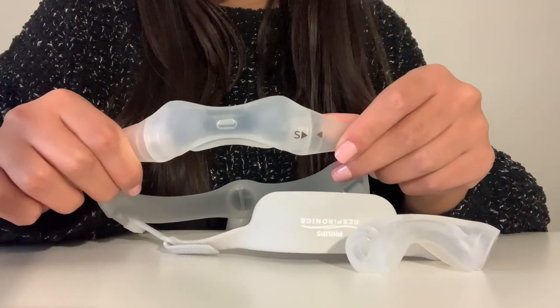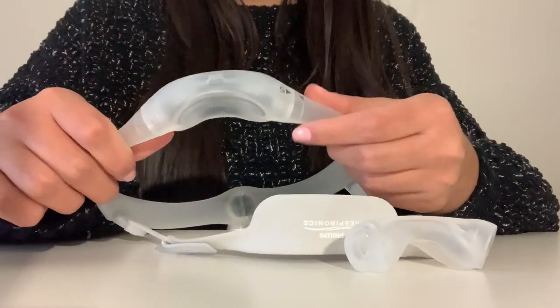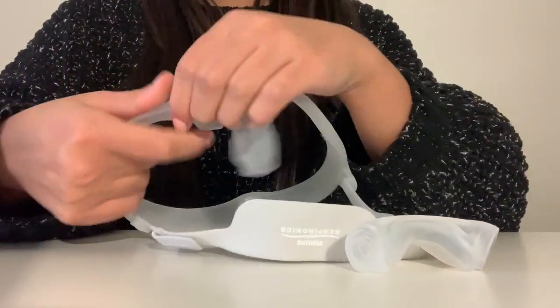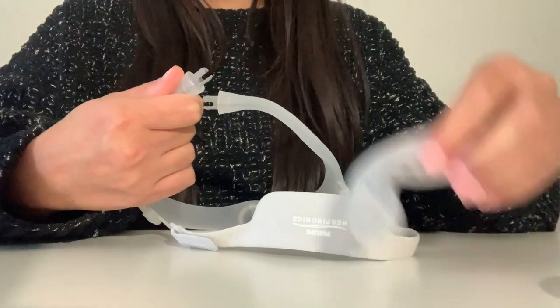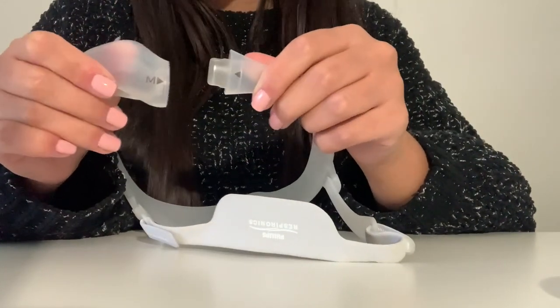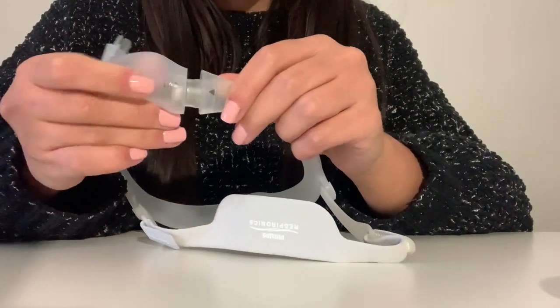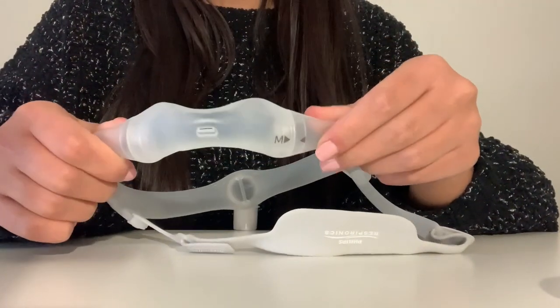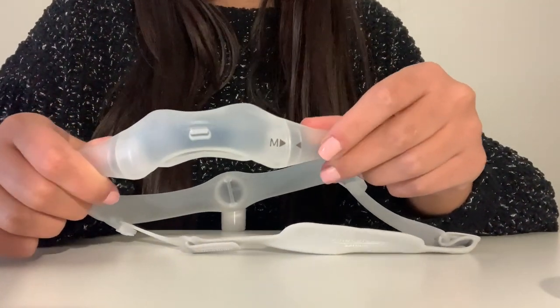It's quick and easy to replace this Streamwear Nasal Cushion. Simply hold the mask in one hand and pull out from both sides. Next, grab your new cushion and make sure these arrows line up and pop it right back in. You'll hear two soft clicks and that's how you know your cushion was properly placed into your frame.